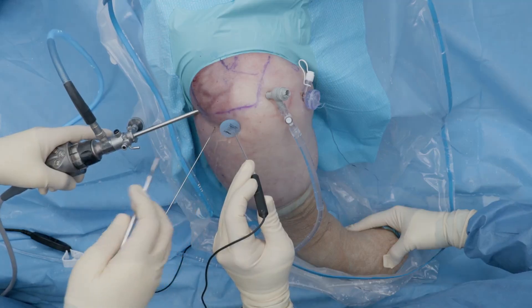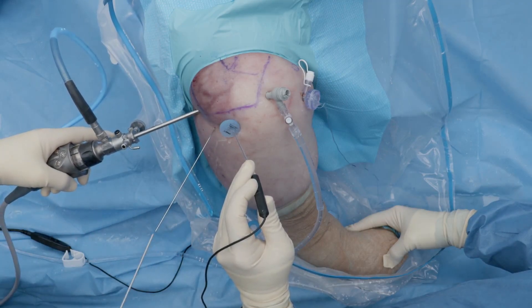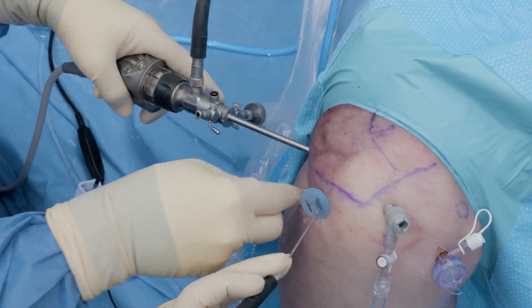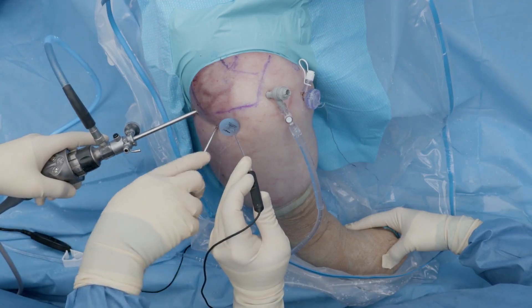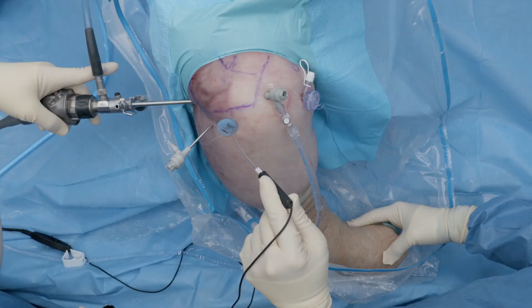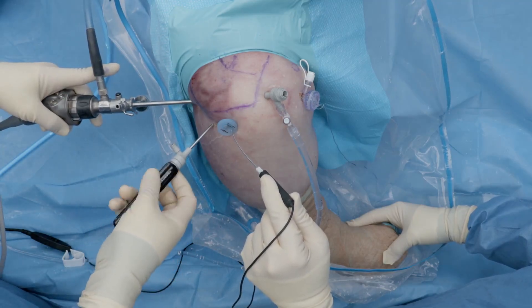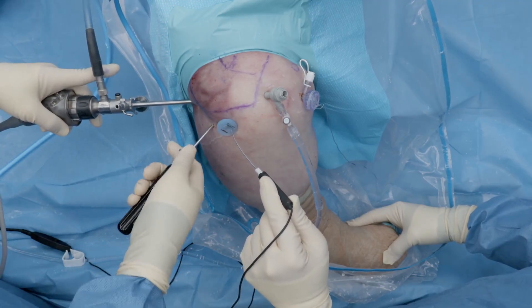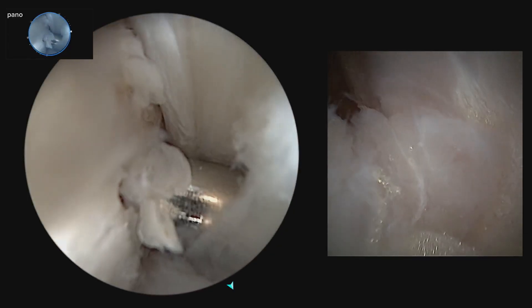We make a little stab incision at our guide wire and dilate over it with the percutaneous kit. We then put the crown tip high flow sheath over the dilator, which acts as our drill guide. Once this high flow sheath is in place, we attach the drill guide handle to complete it as the drill guide for our posterior anchors.